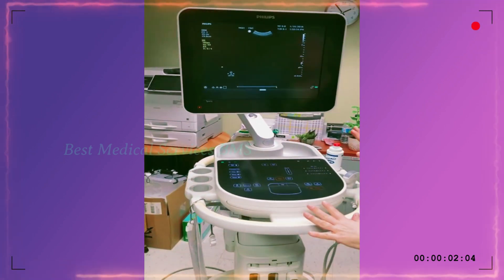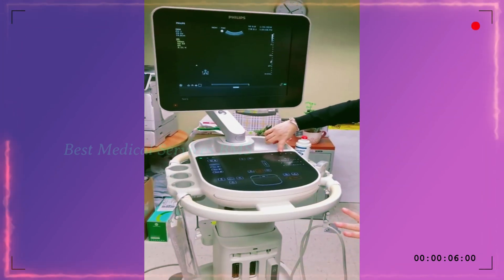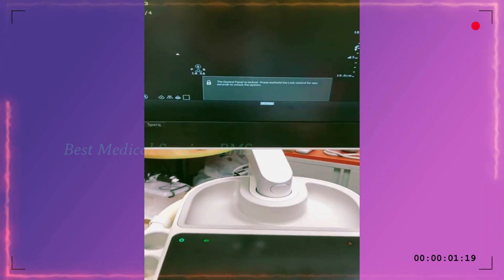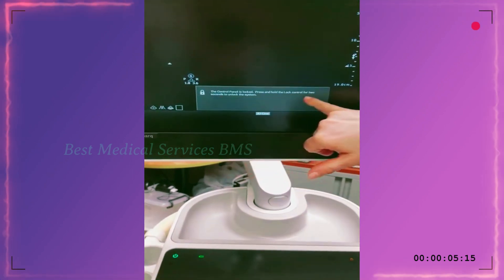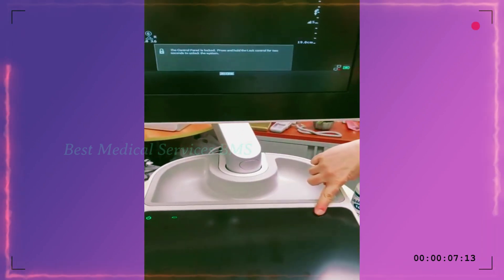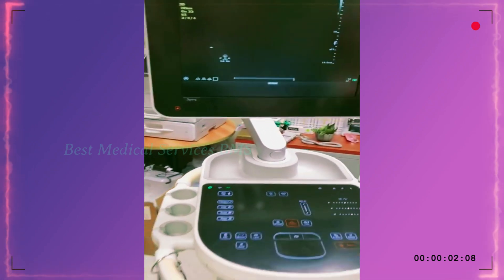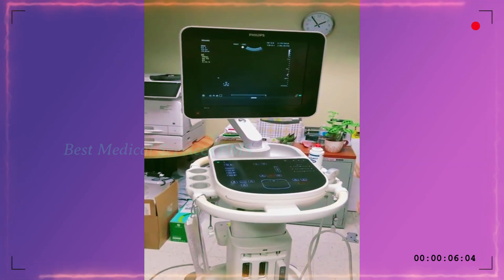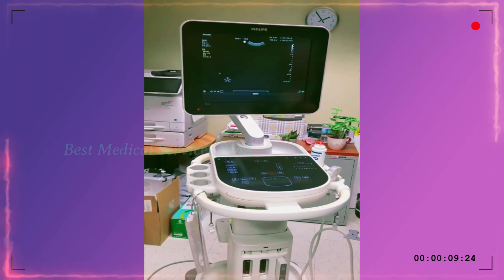If you need to clean this screen, we advise that you touch the lock button. Then you can clean it with the hydrogen peroxide wipes in the green canister. You'll also get a message that the keyboard is locked — just touch it again and it comes back. To clean the screen, just use a damp paper towel on that.